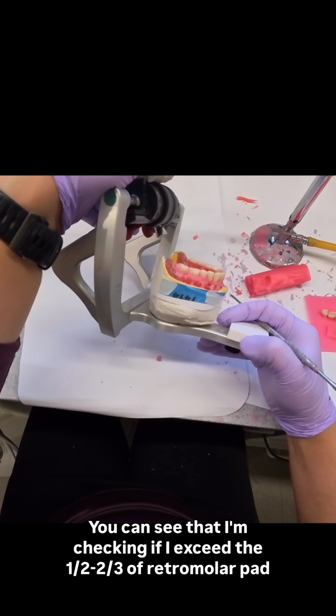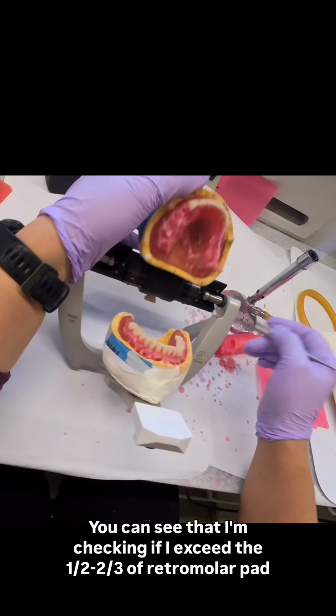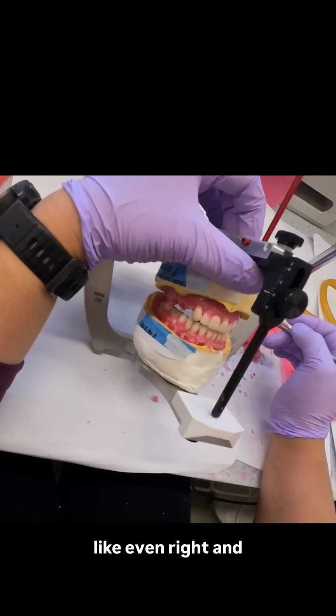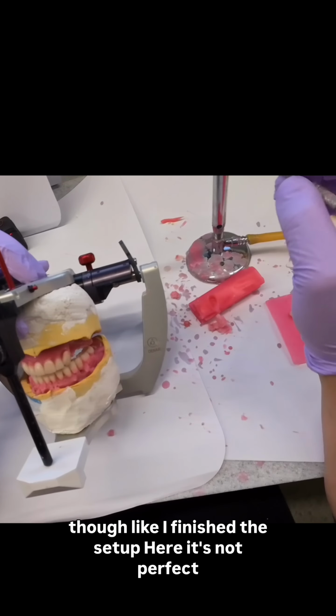And you can see that I'm checking if I exceed the half to 2/3 retromolar pad. Alright, and even though I finished the setup here, it's not perfect.